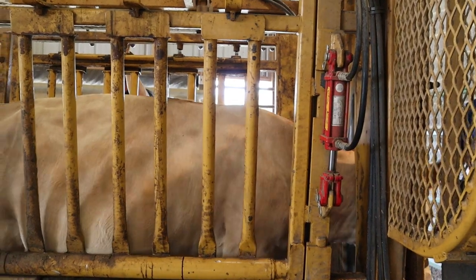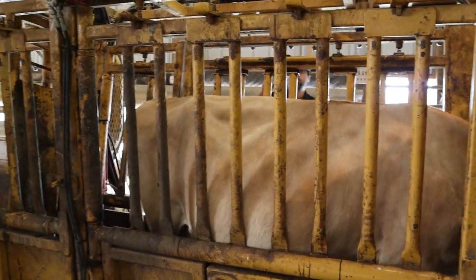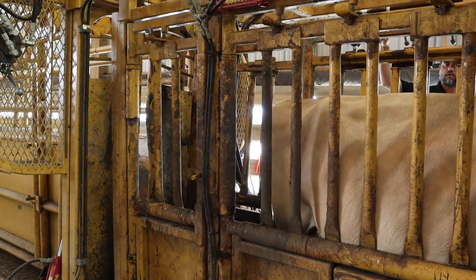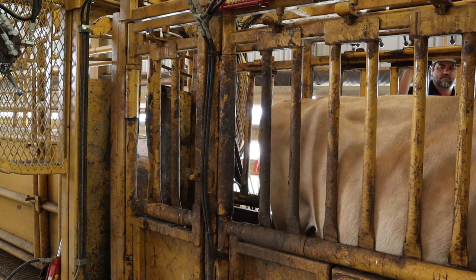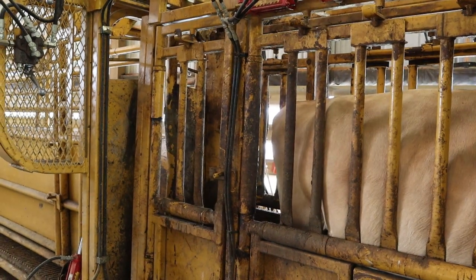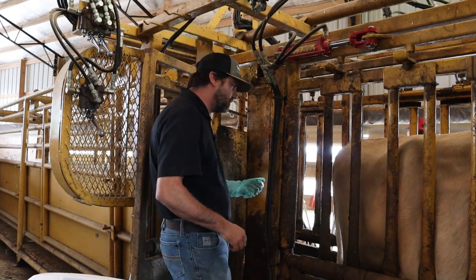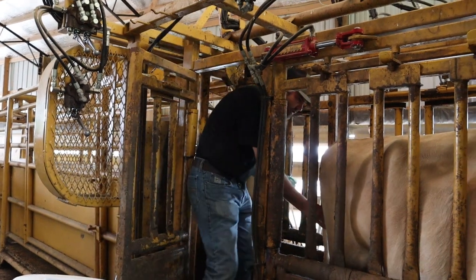There we go. That was easy. What is that, Jackie? 4 months? Yeah, January the 15th is when we took her. And she was due in heat within a couple of days of that. I'm going to go in just rectally right now without the ultrasound and see what I can feel.